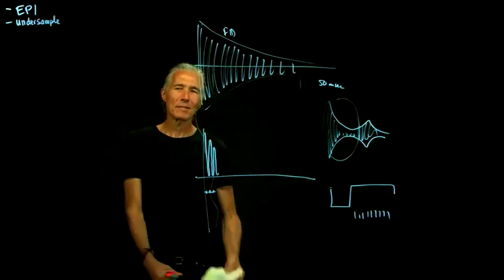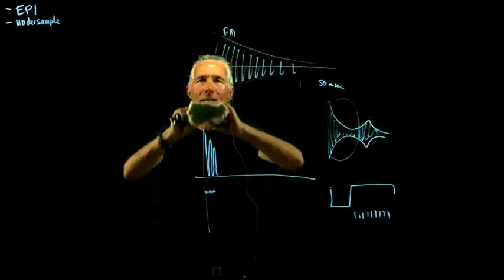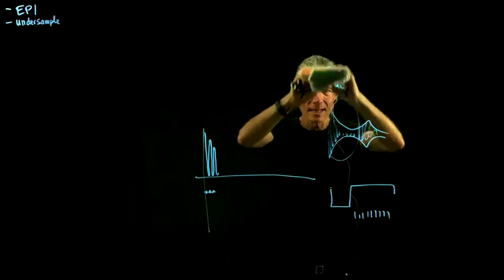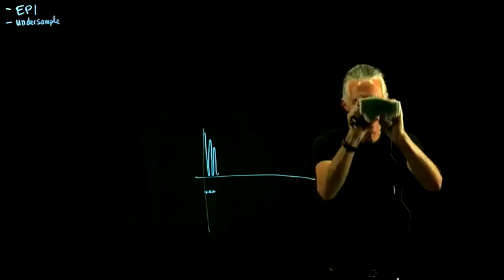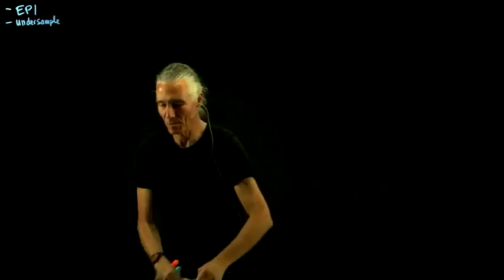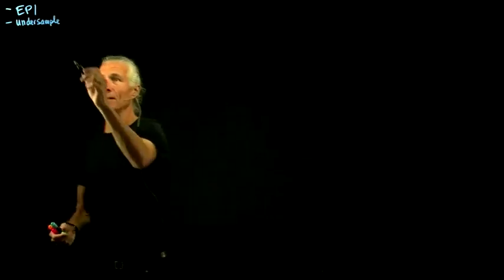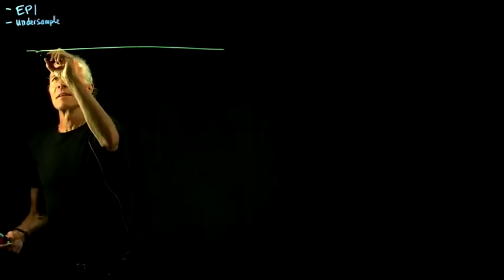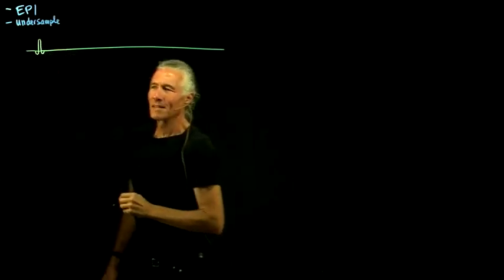So that's in words what Echo-Planar Imaging is. Now let's go over the details of how we actually collect all the echoes needed for one slice, like 64 or 128 echoes. To start, the first thing we do is the fat saturation.